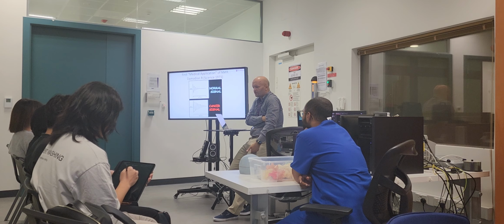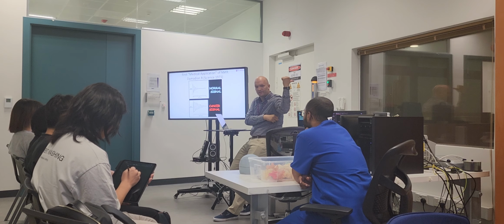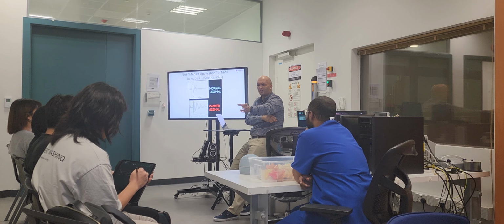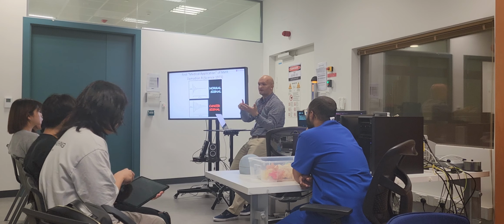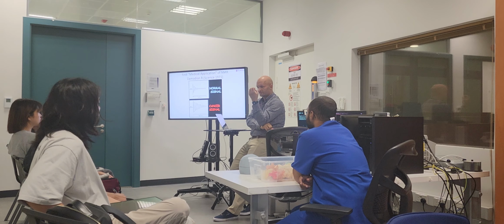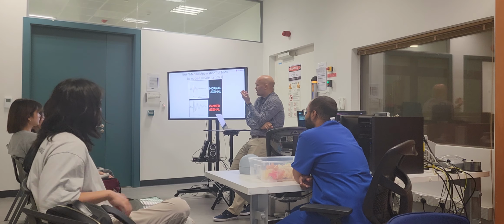The RF frequency we're talking about is 120 megahertz on this machine. They have 500 megahertz, or your cell phone is running at gigahertz. So it's not high frequency, it's non-ionizing radiation. I'm not using X-rays. It doesn't cause cancer. I'm not using radioactivity, gamma waves, alpha waves, whatever. I'm using just radio frequency. It's very non-invasive. And I didn't have to do anything.